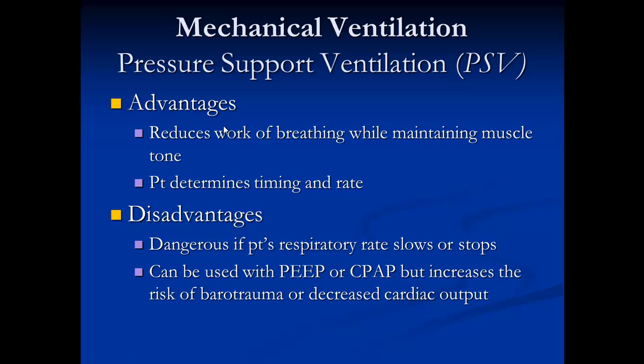Advantages, as I said, it reduces the work of breathing. Disadvantages for that is it's dangerous if the patient's respiratory rate slows or stops. That's the reason why you have to set appropriate apnea alarms. And it can be used with PEEP or CPAP, but increases the risk of barotrauma and decreases cardiac output in some population.